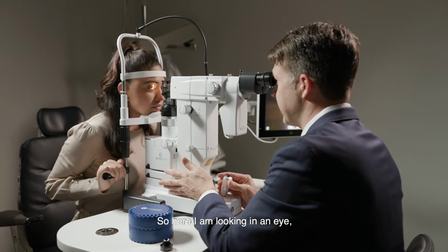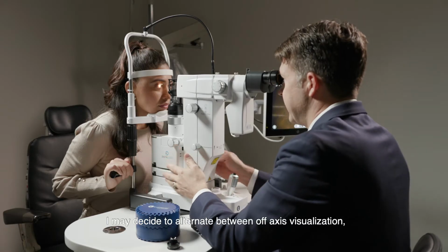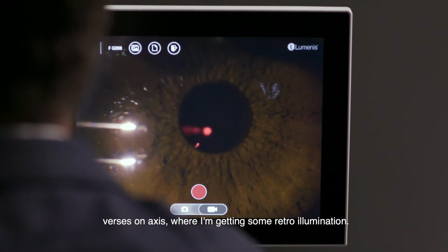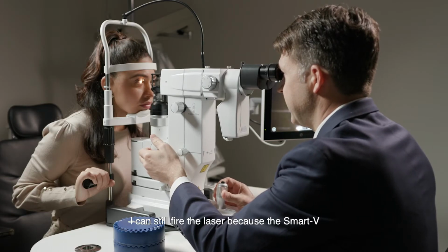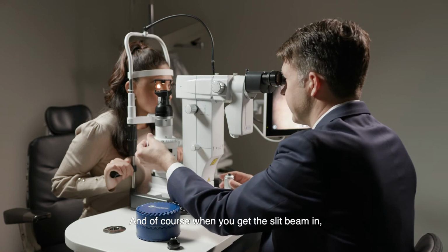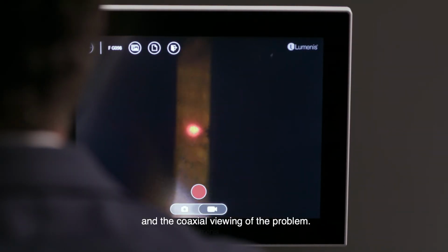So here I am looking at an eye, and first thing I'm going to do, let me take my magnification down a little bit. I may decide to alternate between off-axis visualization. You can see the pupil is dark here, versus on-axis where I'm getting some retroillumination. I can still fire the laser because the Smart V will allow my visualization not to interfere with the laser itself. And of course, when you get the slit beam in, there's a difference between this sort of off-axis viewing and the coaxial viewing of the problem.